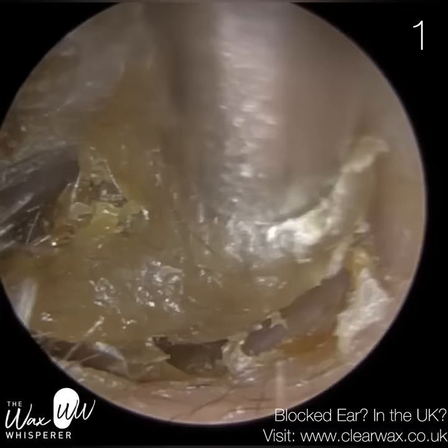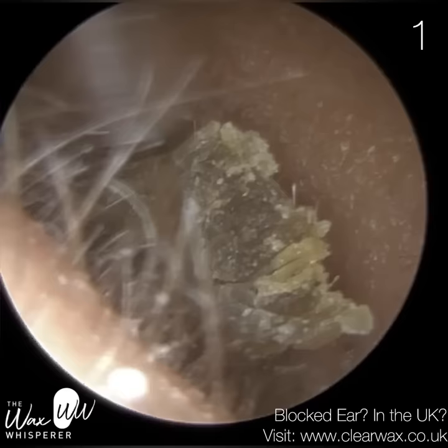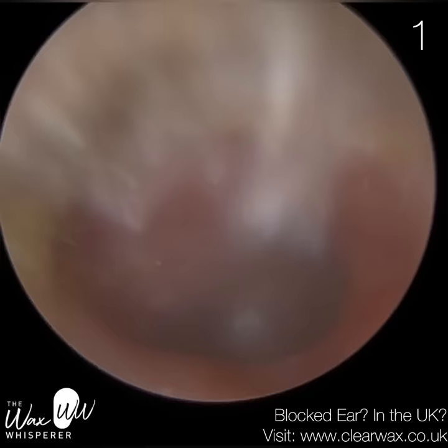This is patient one — they have a blocked left ear and I'm just performing microsuction. You'll see in a moment we've just retrieved this very long plug of really dark earwax, almost looks like a cigar. It's moulded in the shape of the ear canal itself. That came out straightforward.